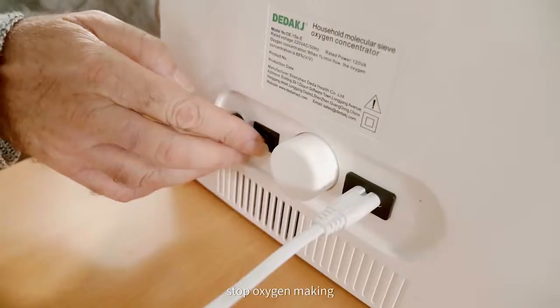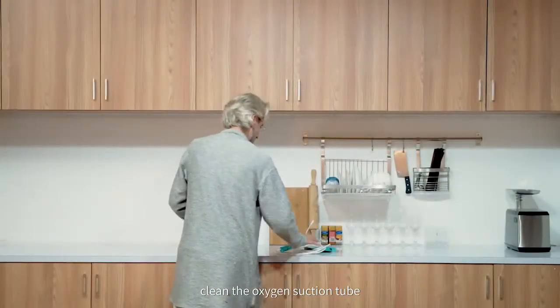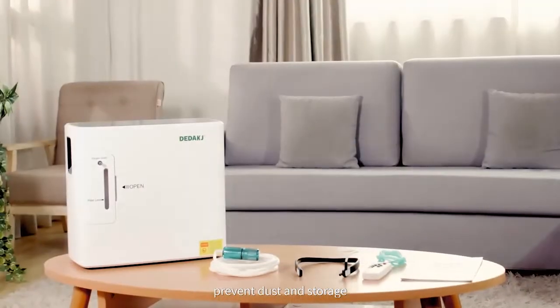Press the OFF key to stop oxygen making. Then turn off the power switch. Clean the oxygen suction tube to prevent dust, and store. To use again, just turn on the power switch.